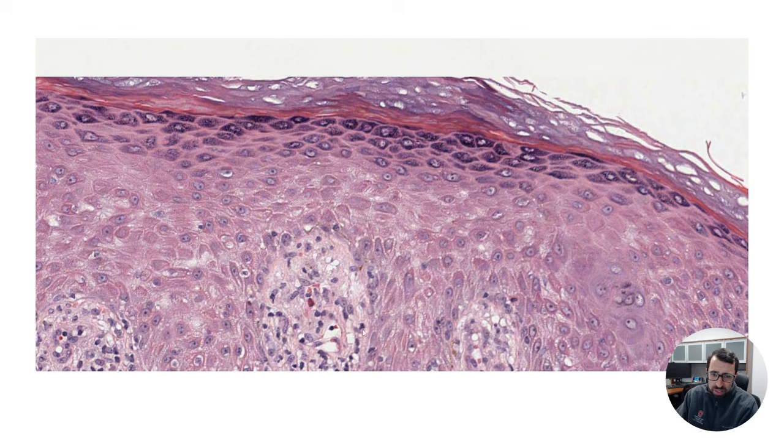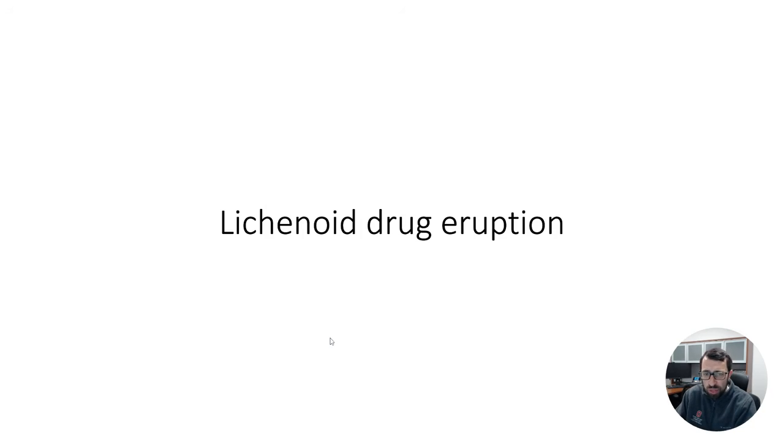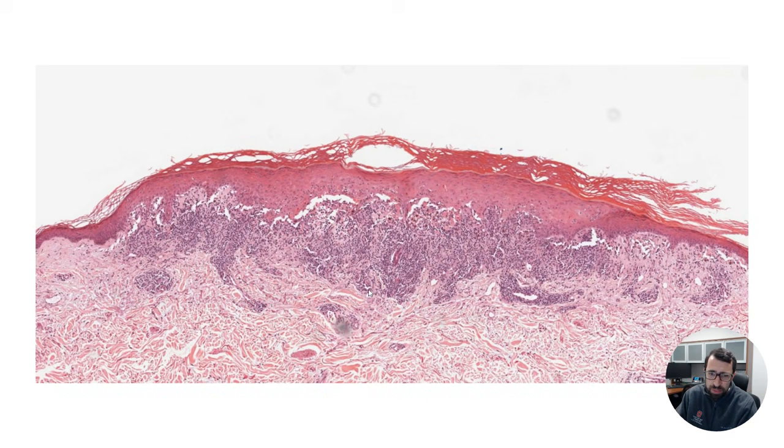Zooming in here, you can see it's disrupting the dermal epidermal junction. I kind of clipped this for myself back in the day to show a single eosinophil here. So with the lichenoid lymphocytic infiltrate with the eosinophil, what I was trying to feed myself at the time was lichenoid drug eruption. Note that the percentage of eosinophils doesn't really vary between these, so it's not really a reliable histopathologic differentiator, but it's often mentioned for boards purposes.